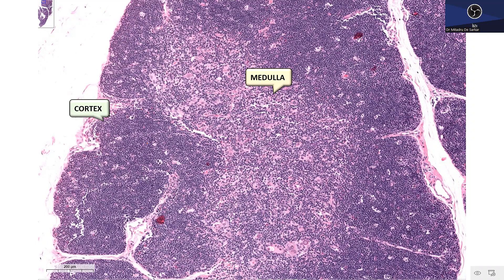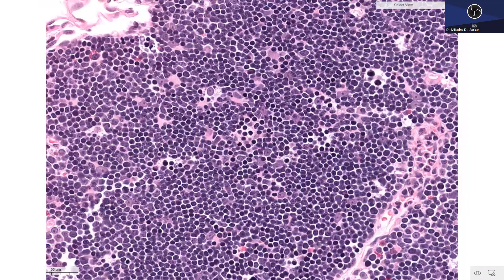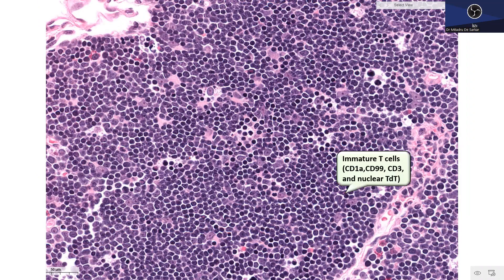The cortical immature T-cells express CD3 along with TDT and other immature T-cell markers. At high power, the thymic cortex contains immature T-cells expressing CD1A, CD99, CD3, and nuclear TDT. The macrophages responsible for the starry sky pattern stain with CD68 and CD163.